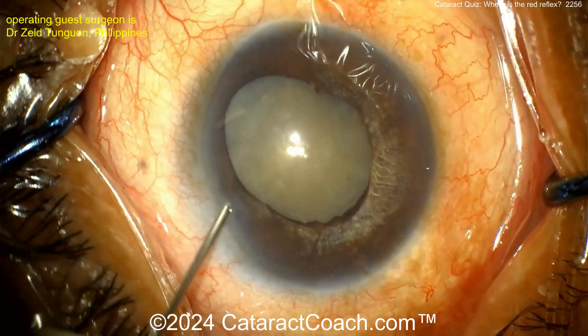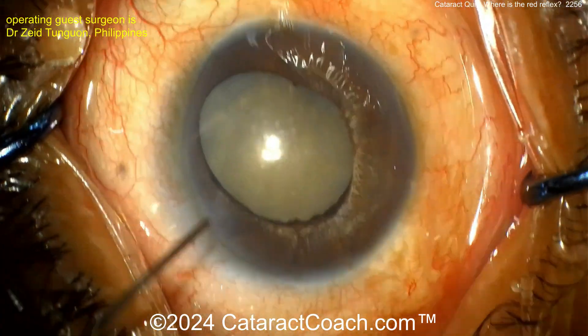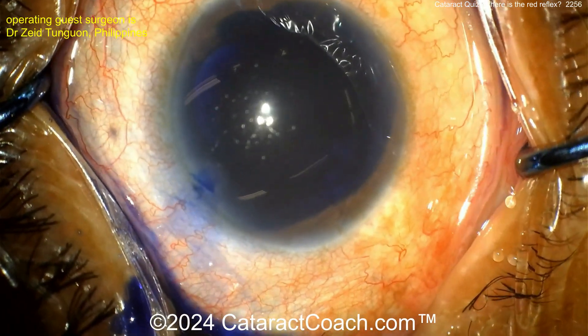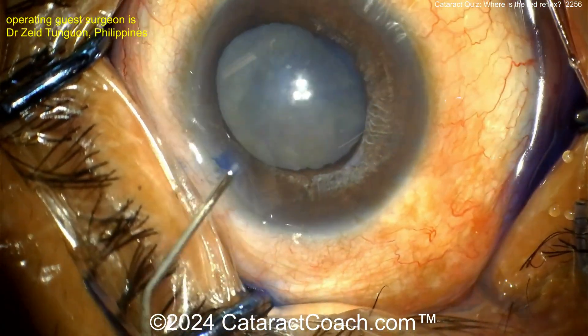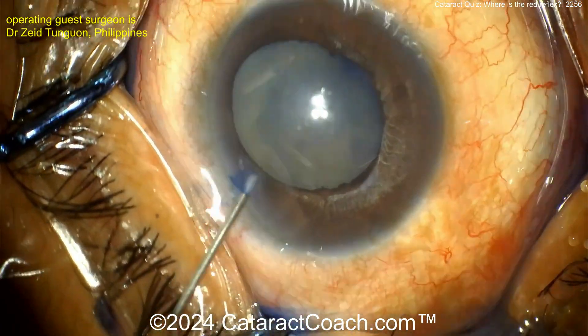Now it's time for viscoelastic, and then let's try trypan blue dye going in. A big aliquot of trypan blue dye — no air bubble in this case. Dilute it out. But is this a traumatic cataract? Is there traumatic zonular loss?